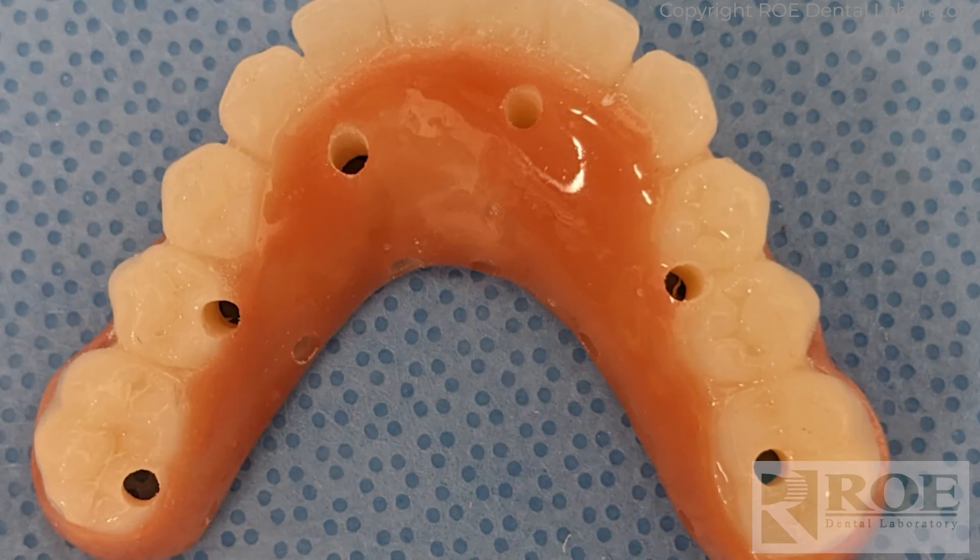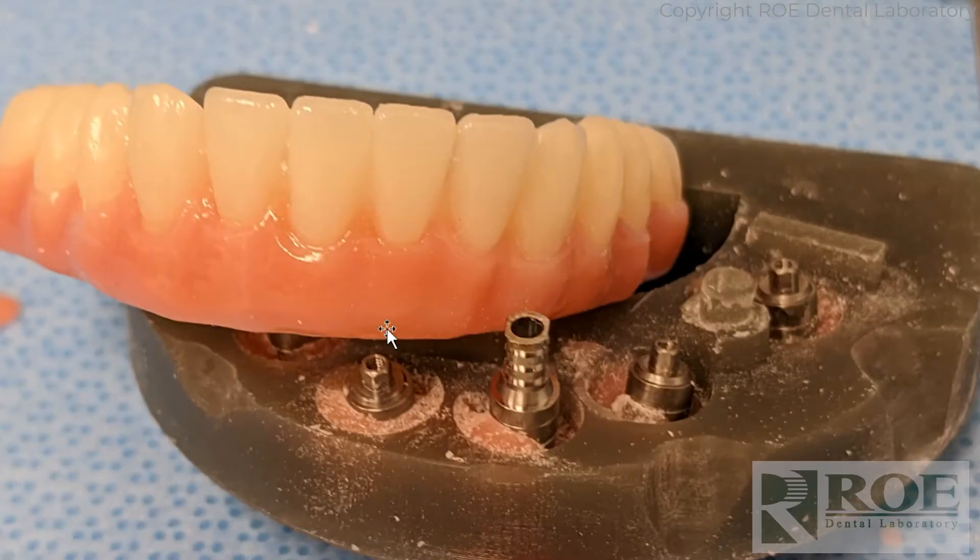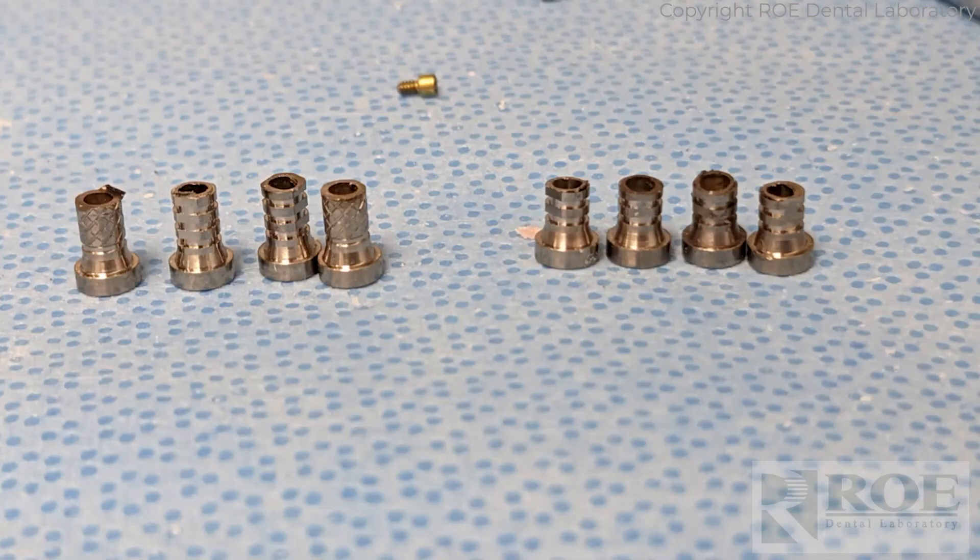Here it is with the holes drilled. The next step in C2F is to one by one place the temp cylinder on the model and either adjust the metal or adjust the inside until you have a nice passive positive seat, then move on to the next. We started using short and long temp cylinders so you have less adjustment. We keep these on hand when going to surgery, so if you need a short you grab a short instead of hollowing out the prosthetic more or cutting metal down. A little trick.